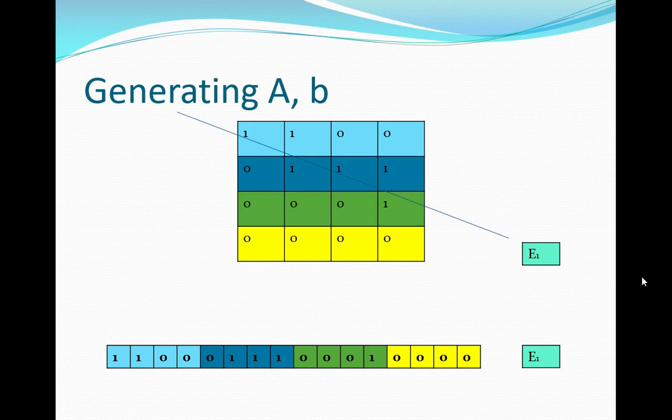Right. Because in the future, as computers get faster, better, and we parallelize things more, that's absolutely within the range. And so that is the right assumption to make. Just at the moment, the technology is too slow. What we define as too slow is that doctors will wait up to 5 minutes for this. So we have to be able to go from scan to image in 5 minutes. That is what we call clinical.